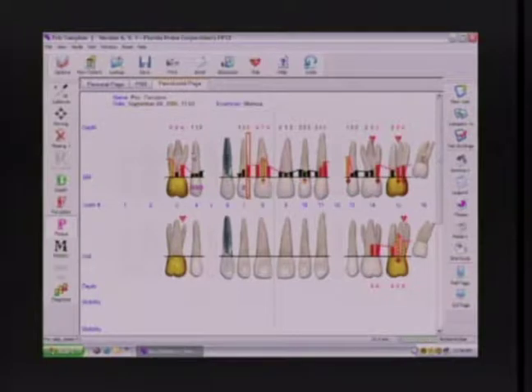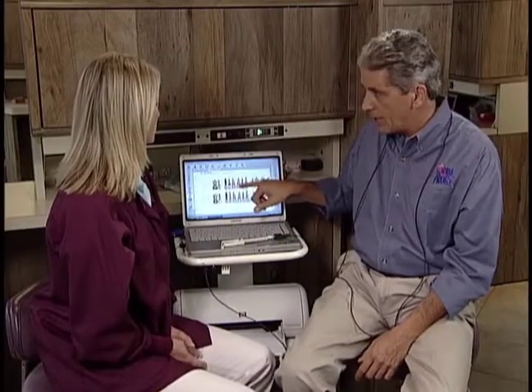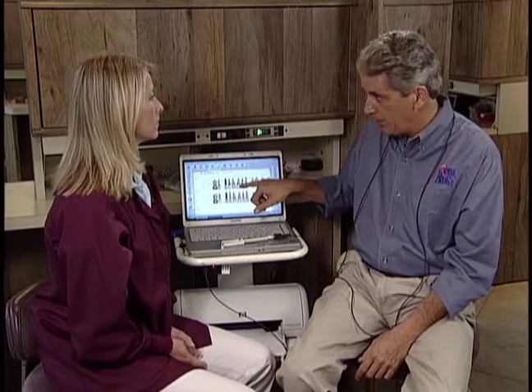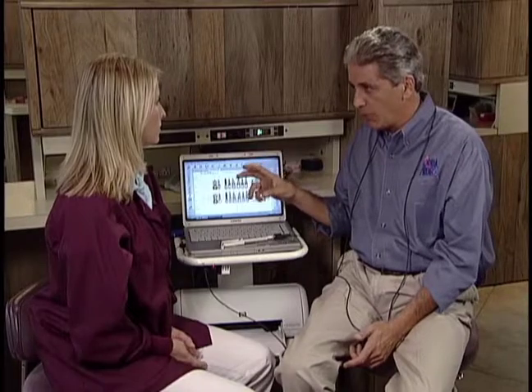Quick taps advance, hold and listen. Black. Now, let's be clear, black, black, black. Midline. I'm going to advance this with the arrow key. Black. Plaque is really 4 sites per tooth. Even though on the buccal aspect here it's recorded as 3 and 1 on the lingual, that's because as we're conducting the buccal pass, we collect the interproximal data. So when we come back on the lingual pass, we're only doing the straight lingual. Does that make sense?